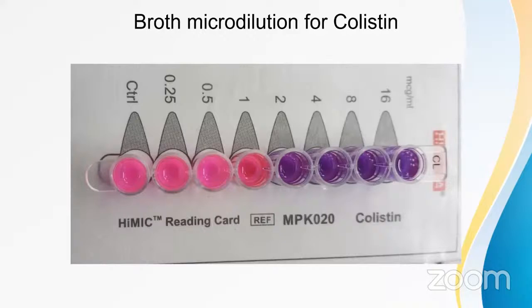So these are the new ones. This is broth microdilution for colistin. These are the cards available. You can see where the color changes to purple. That's the MIC of colistin.